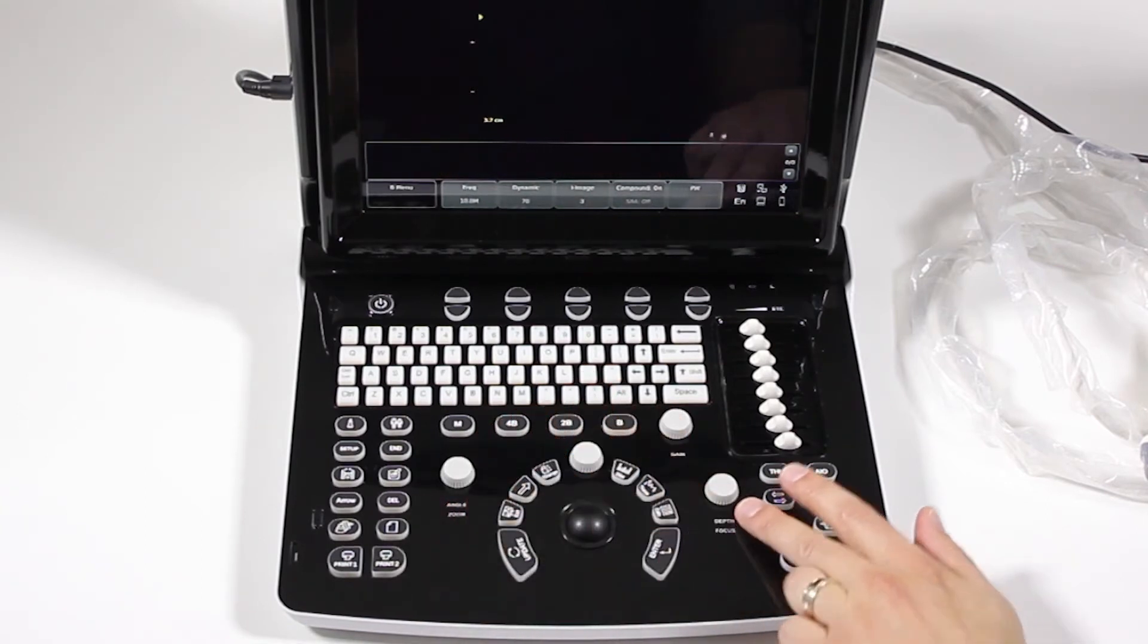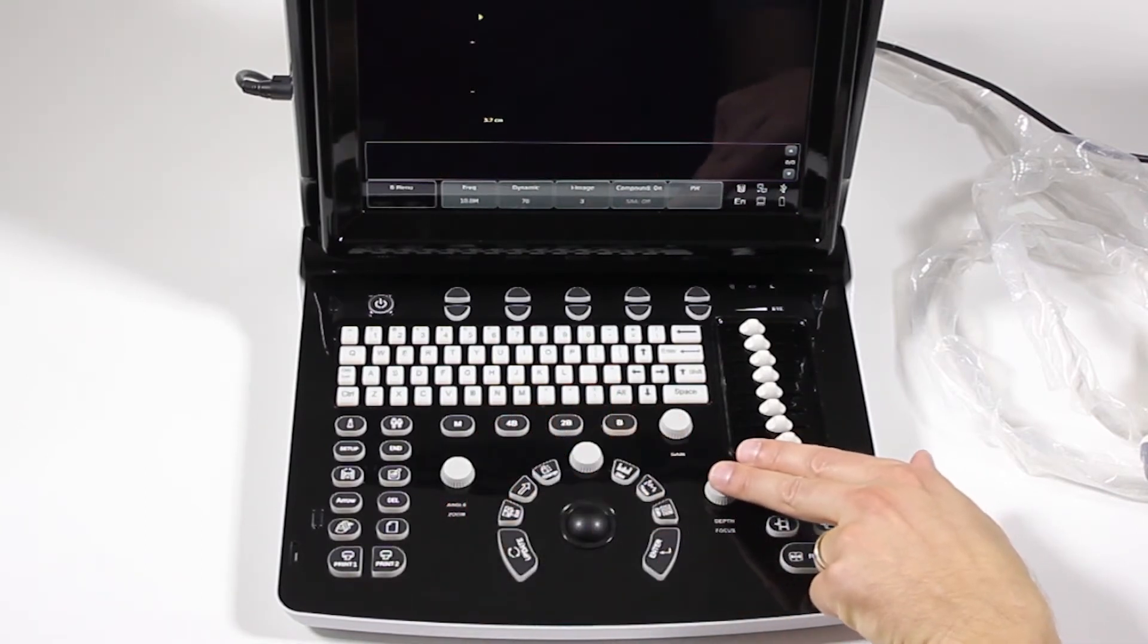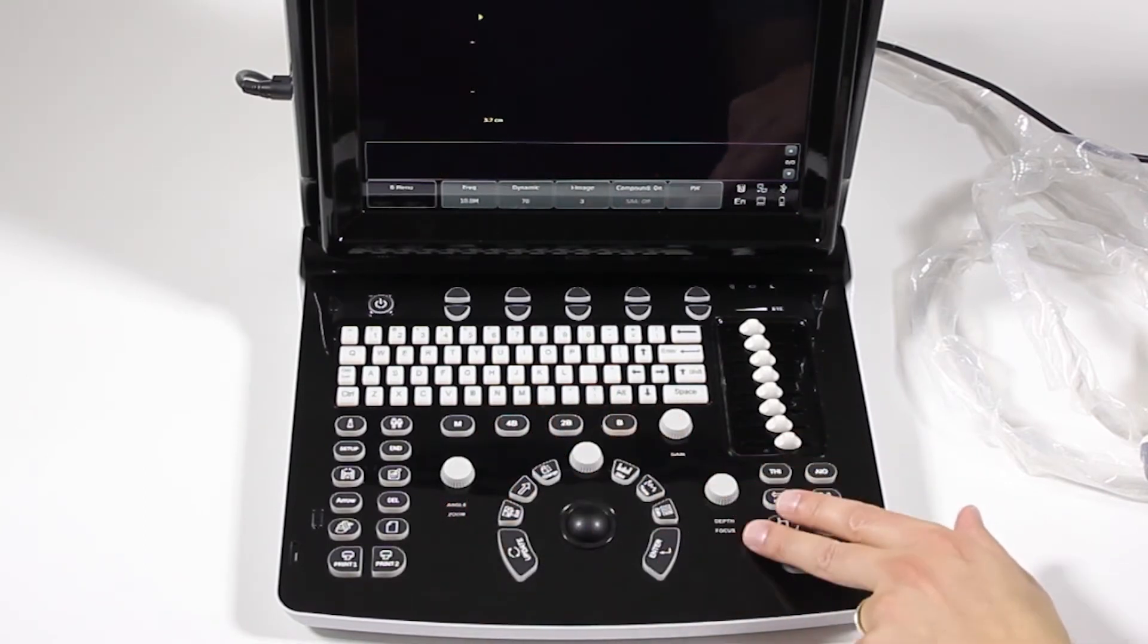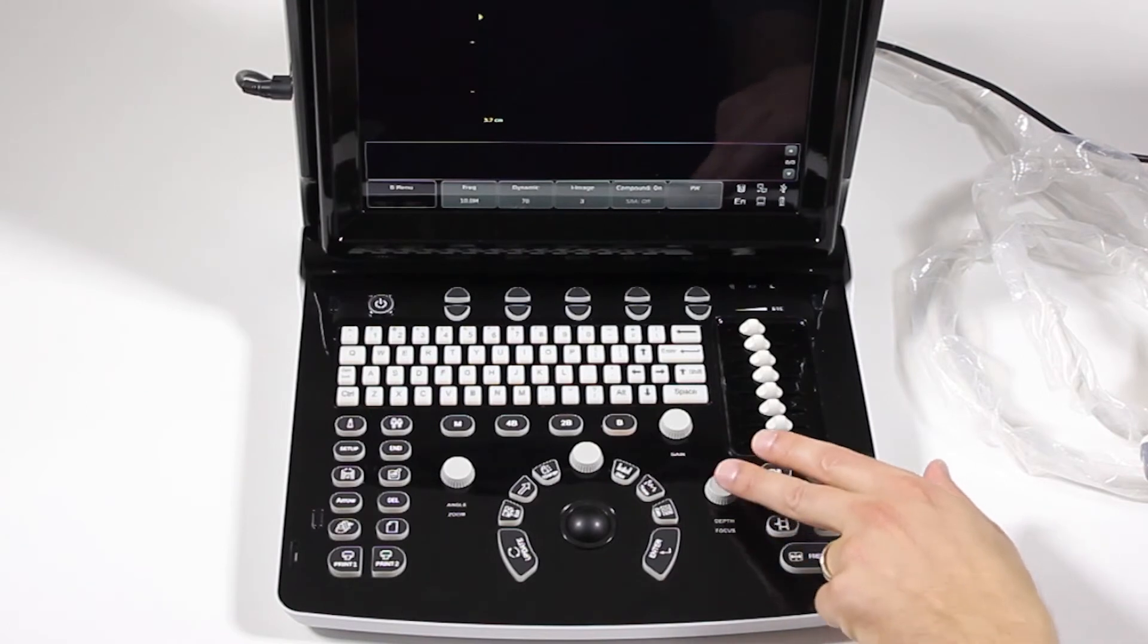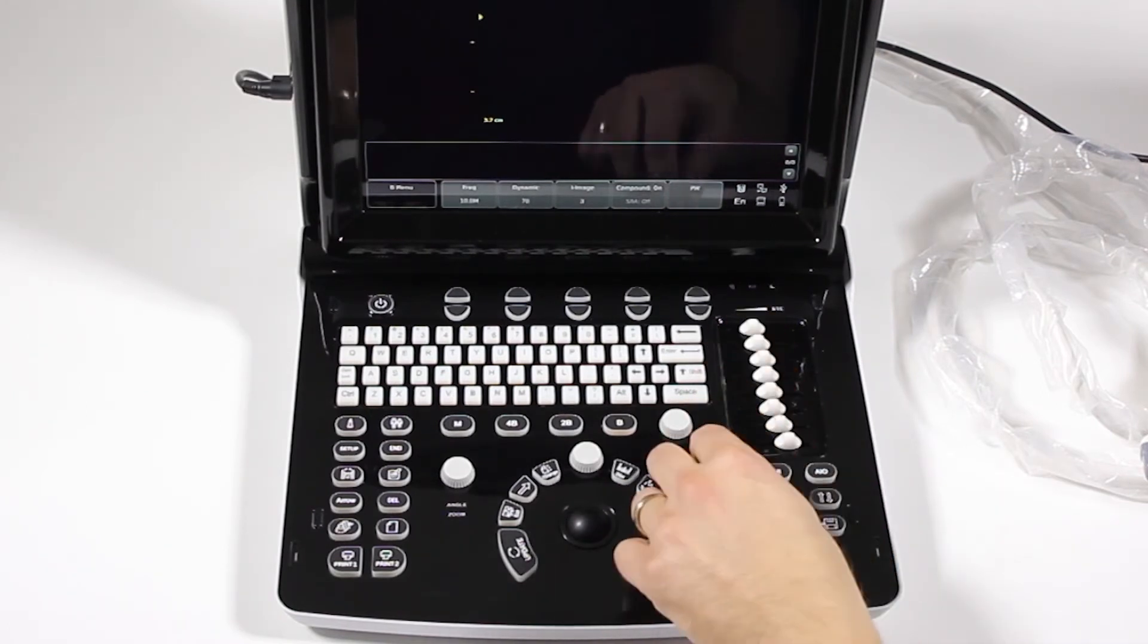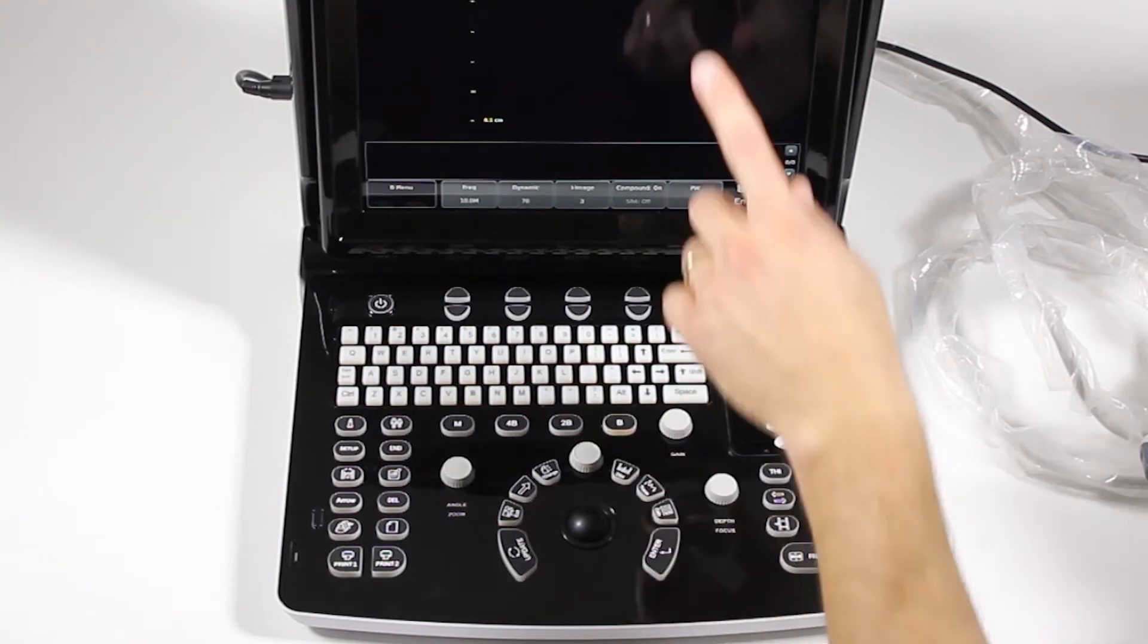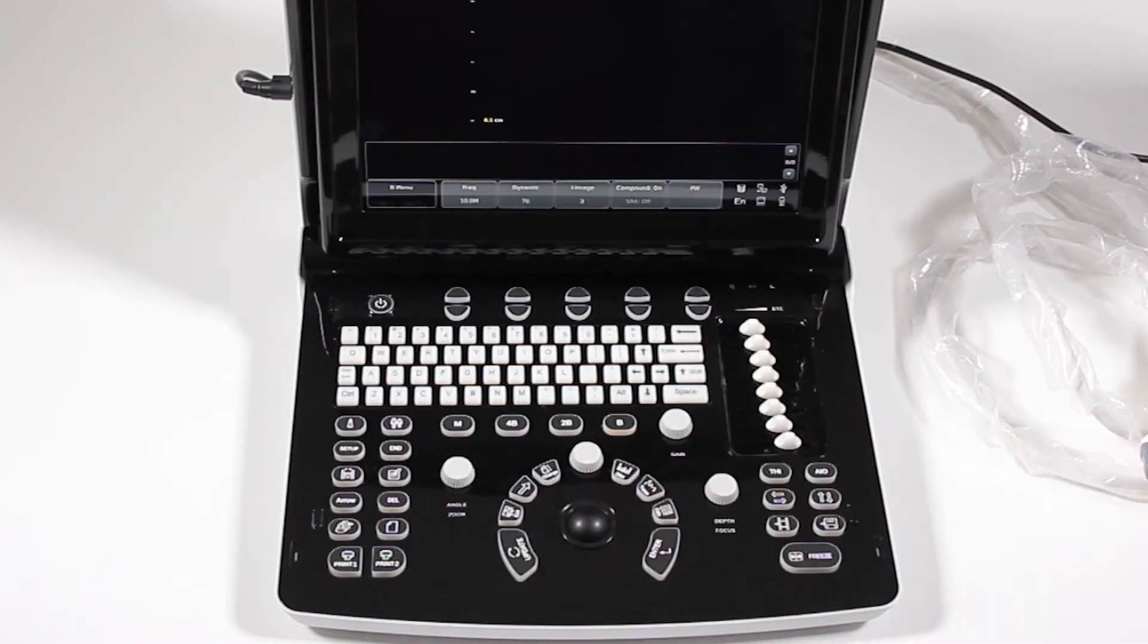We have our gain, depth, and focus, and some of these you can push down. So right now, if I push it down, focus highlights. If I push down, and then it goes to depth, and this will be twisted in order to adjust that parameter on the screen.